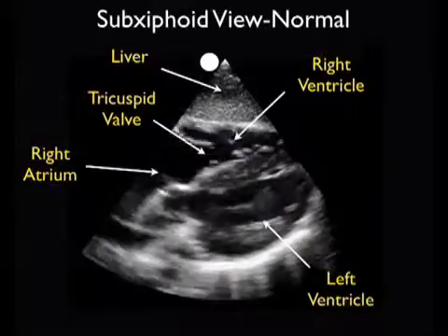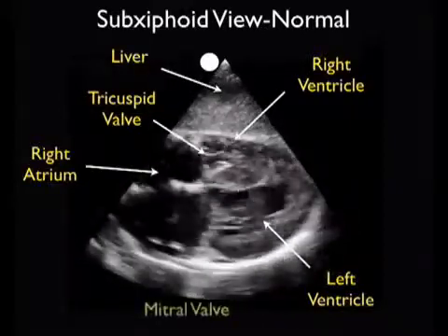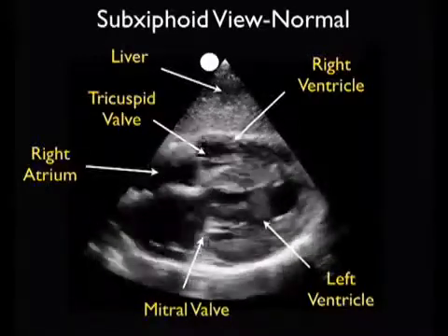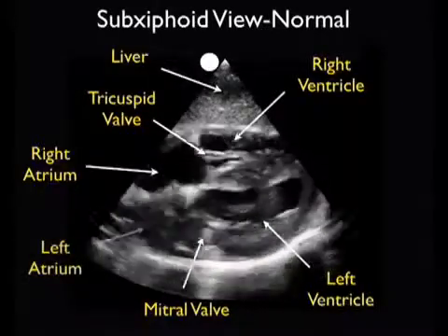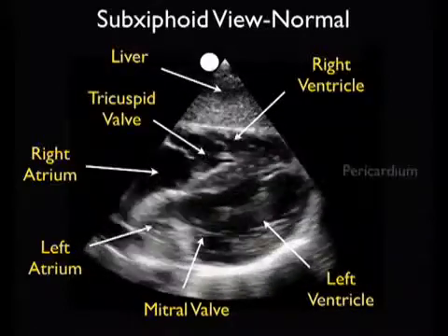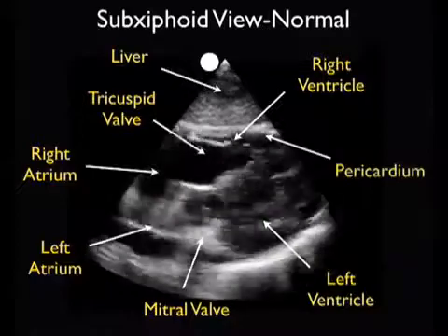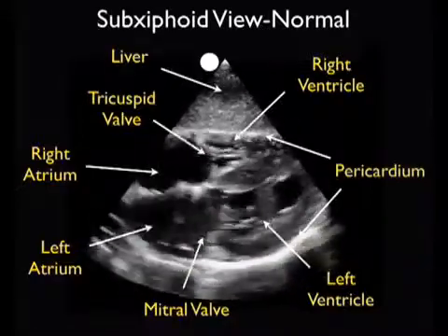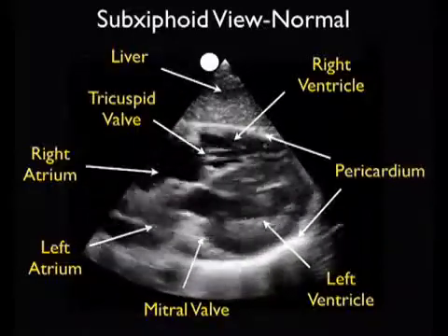Notice the tricuspid valve flipping up and down in between the right atrium and the right ventricle. Looking posterior to the right ventricle, we appreciate the left ventricle — notice again its more muscular and hypertrophic walls. Just to the left of the left ventricle, we appreciate the left atrium, and we also get a glimpse of the mitral valve flipping up and down. Note the white line of the pericardium both anteriorly above the right ventricle and posteriorly below the left ventricle, with an absence of any significant pericardial effusions.